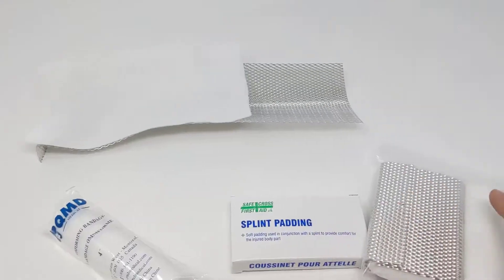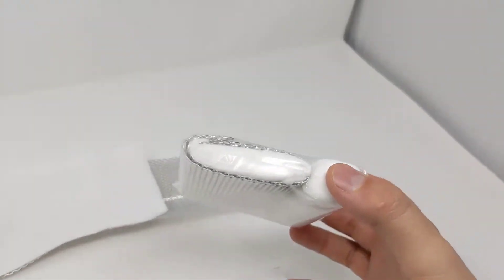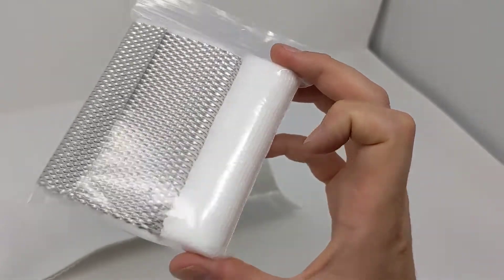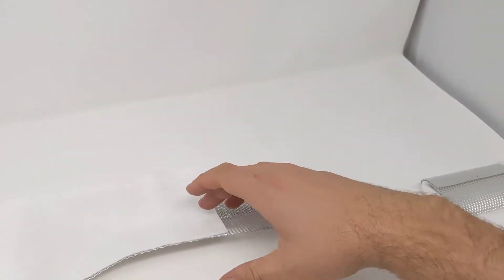So just another option for splinting — we're going to be carrying these ultralight splint kits that'll be a wire splint with two pieces of splint padding and a four-inch roll of roller gauze. This would make a perfect splint, especially for kids.